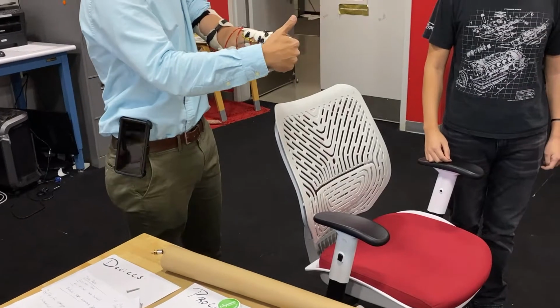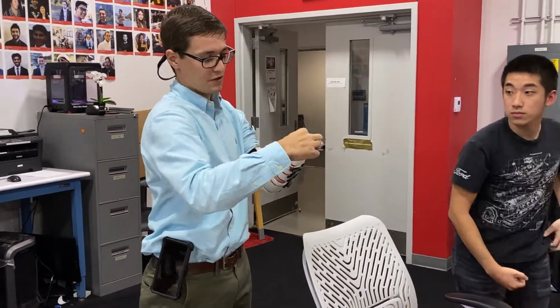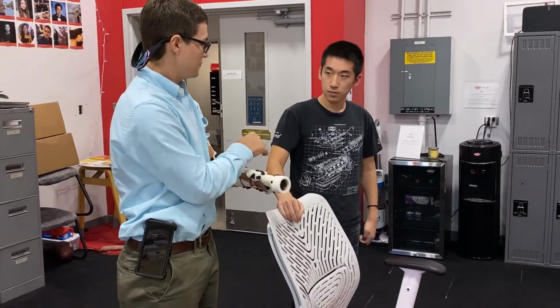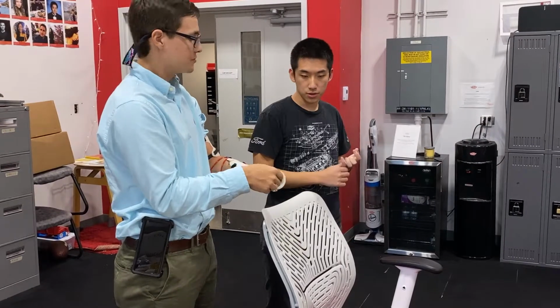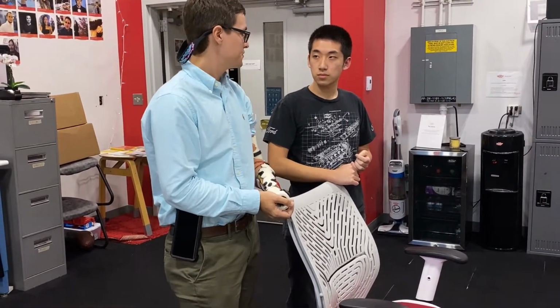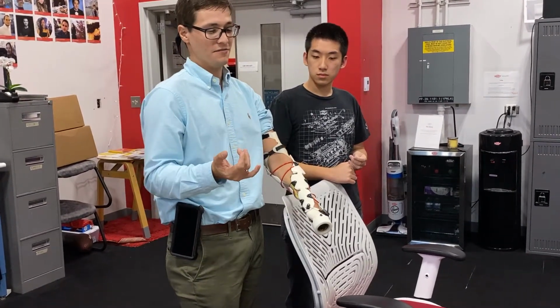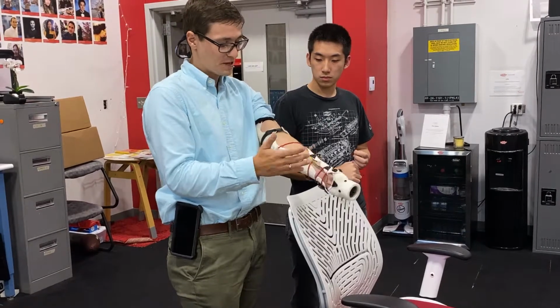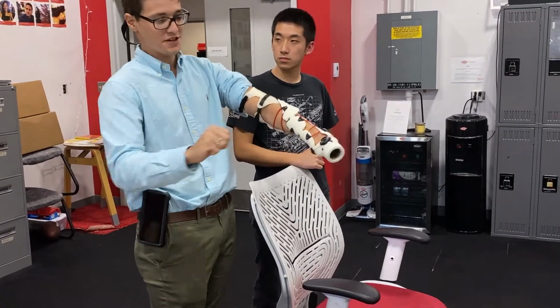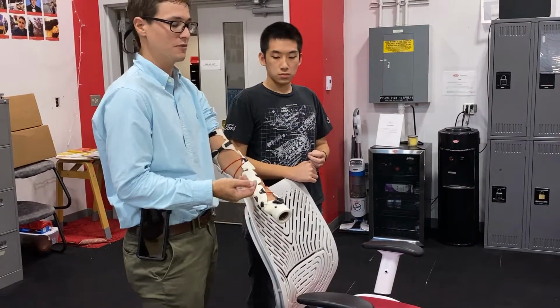Right here is a socket for a bionic hand. We made the inside ring, but we custom fit a portion of the 3D printed part to fit that ring. It fits the other hand as well too? Yes, it's a modular device, so we're able to fit multiple different devices into it, which is the idea when using this in a lab for testing the ability of myoelectric sensors to pick up when you're moving. If a sensor is stretching or being deformed over a surface, you get a decrease in signal or perturbation of signal.